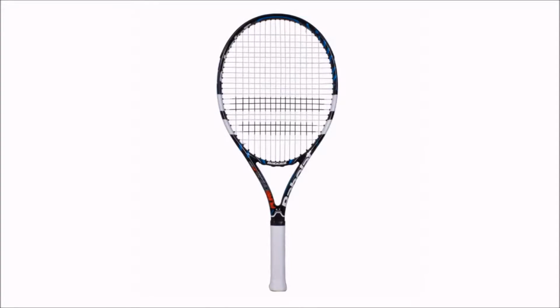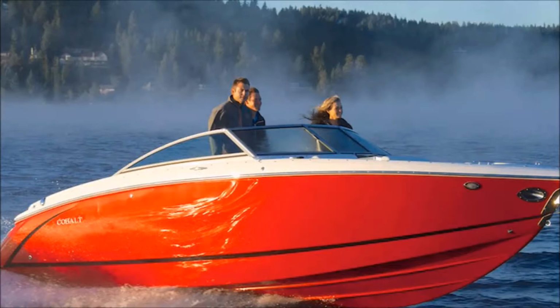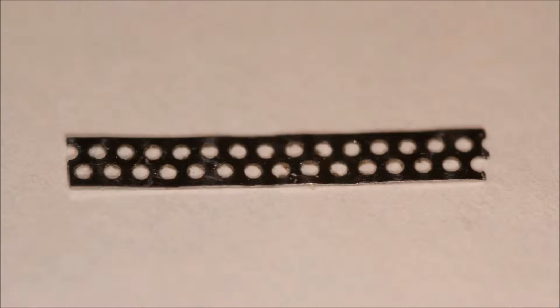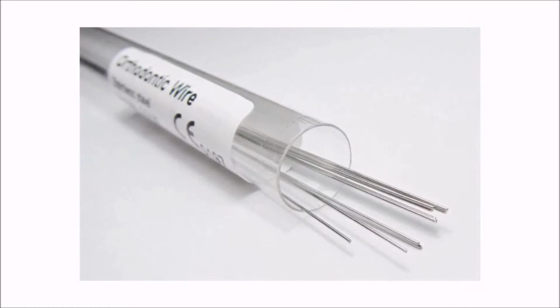Fibers are used to reinforce industrial resins to make tennis rackets, boat hulls, and airplane body components, such as the Boeing 787 and the Airbus A350. Metal meshes and metal wires are not used for these industrial applications, as they are not effective reinforcements.